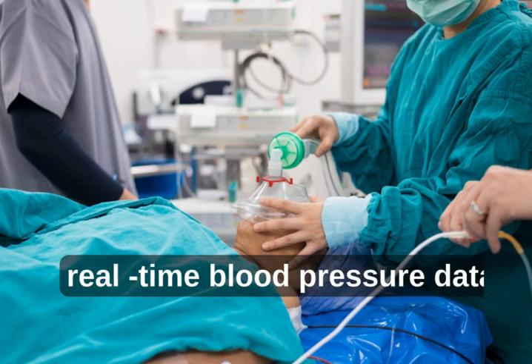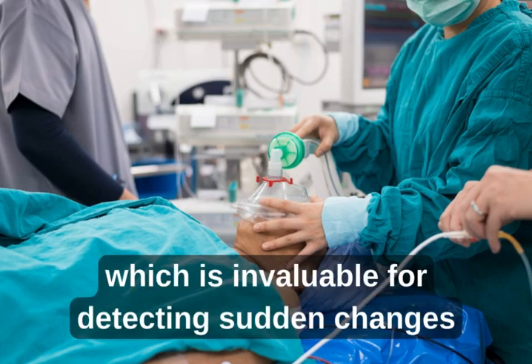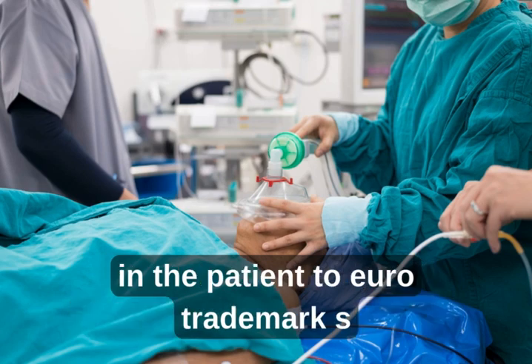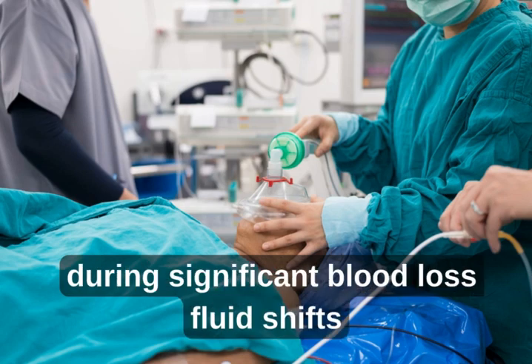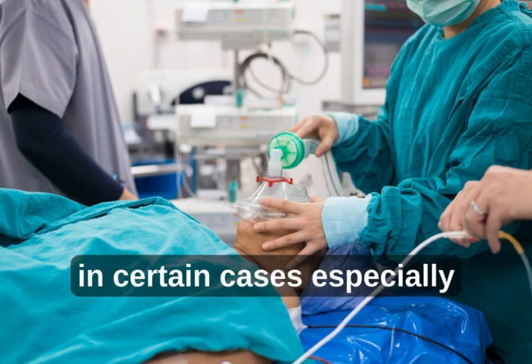This offers continuous, real-time blood pressure data, which is invaluable for detecting sudden changes in the patient's circulatory status, especially during significant blood loss or fluid shifts.